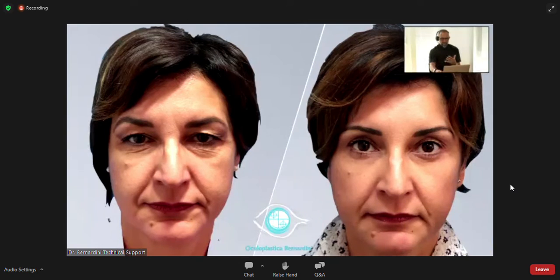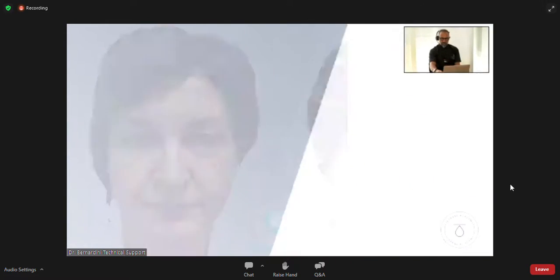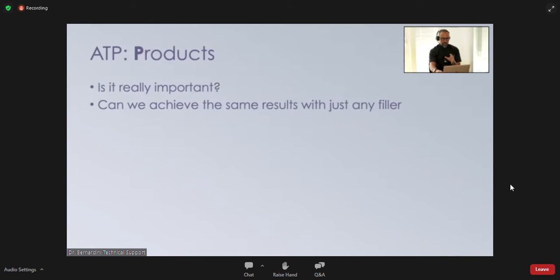And again, another skin. I could have done even injections here, but sometimes surgery is about not only the lower lid, but the entire periorbital region. Even if you did nice work on the lower lid, eyelid-cheek transition, you would still get upper droopy brows and lids. So here again, the indication was surgical, full mid-face rejuvenation with endoscopic surgery, upper blepharoplasty, lower blepharoplasty, and this is the kind of result you can get.